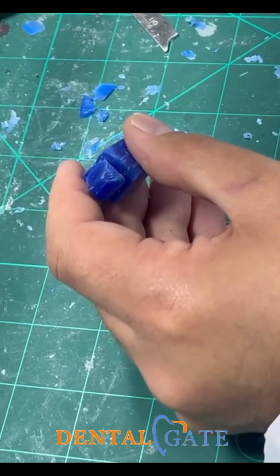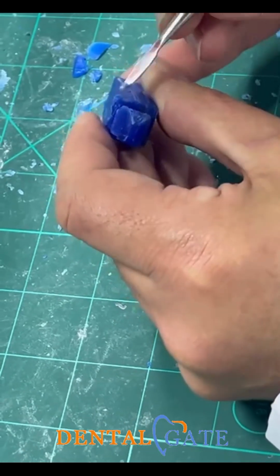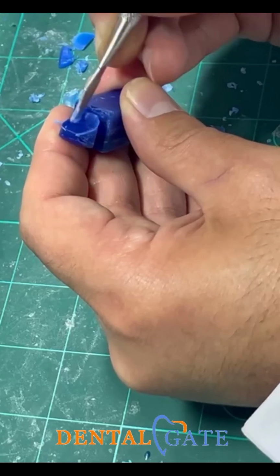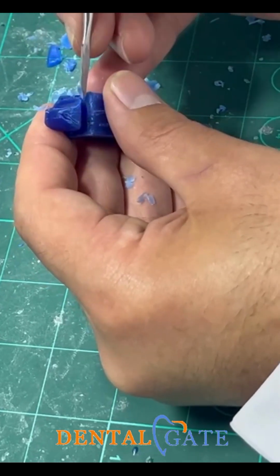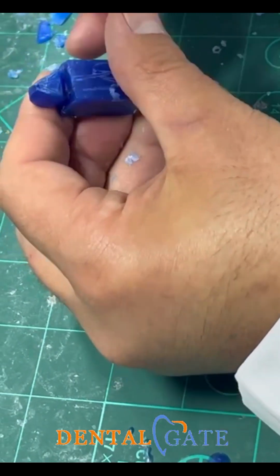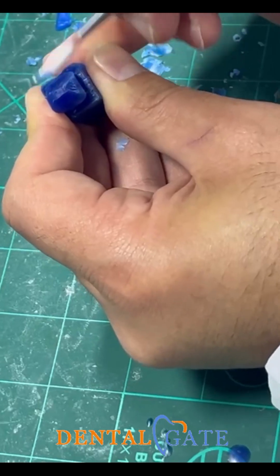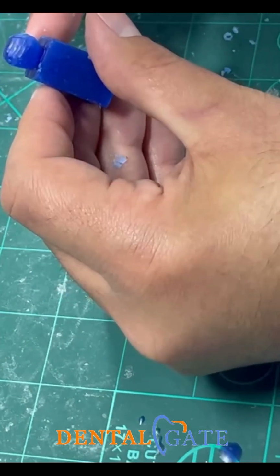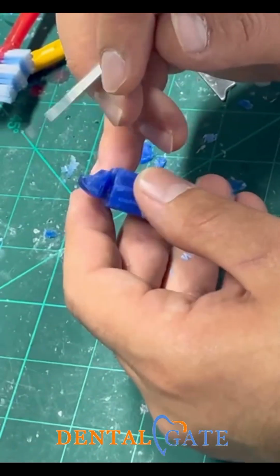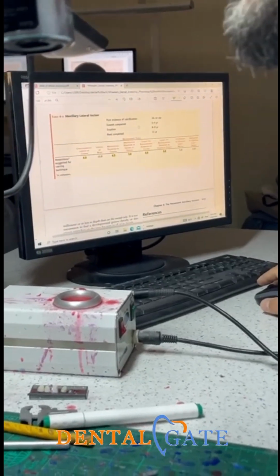As we mentioned, we had a wide fossa in the lateral incisor. It is now clarified within the outline. Now I just need to make a final shape according to the outline. So in the further stage, I just need to make a roundation. I will complete it. Thank you for attention. For the lateral incisor, we will make a revision to the outline for you.